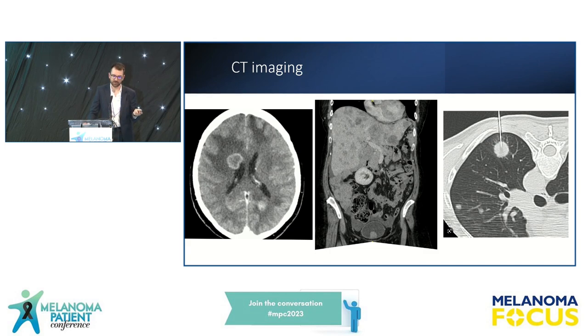I think pretty much all district hospitals have CT scanners, and then there's a move from the government to move towards these regional diagnostic centers to take imaging closer to patients rather than them having to travel into teaching hospitals, etc. And it's very, very useful. So here we can see that it can pick up brain metastases in this patient here. It can pick up disease in the abdomen, in the liver, and in the bladder in this patient with extensive stage 4 melanoma. And also we can use it to guide our biopsies and drainage procedures as well.